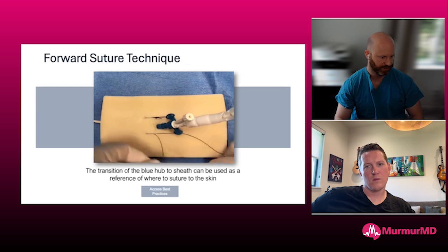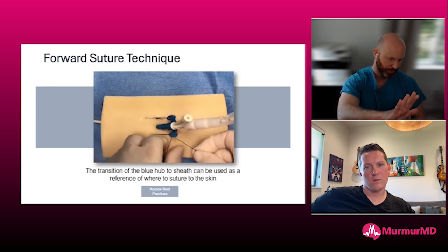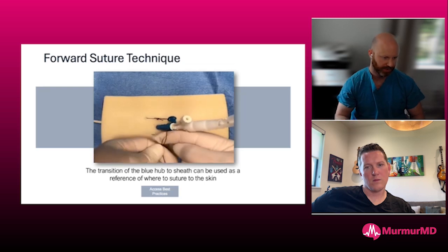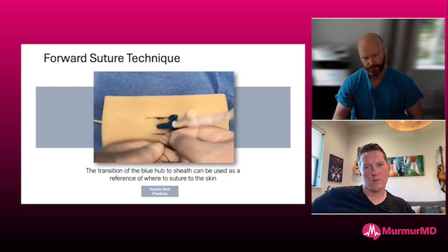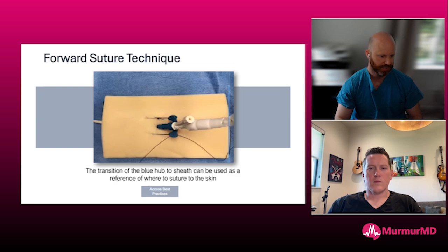I think that actually messes with the angle of the arteriotomy more than it needs to. And frequently the reason we see bleeding out of these is that people are either pushing down on the arteriotomy, meaning pushing the Impella down against the skin, or they actually put too much gauze underneath it and they prop it up too much. And instead of being at the angle of entry, 35 degrees, they're either up at 45 or down at 25, and that actually causes an ooze that's worse around the repositioning sheath than if you just leave it at the actual angle of entry.